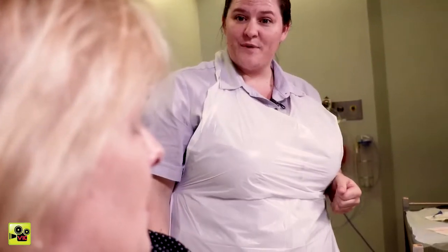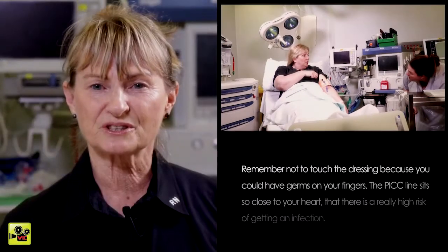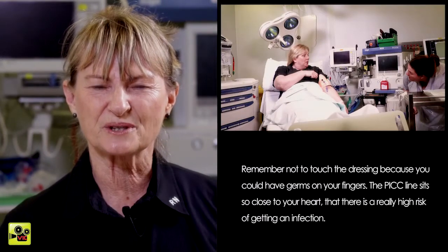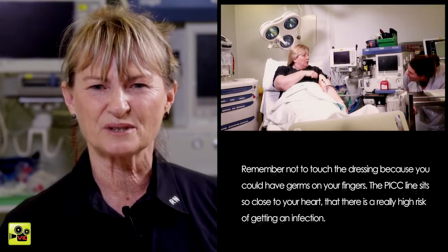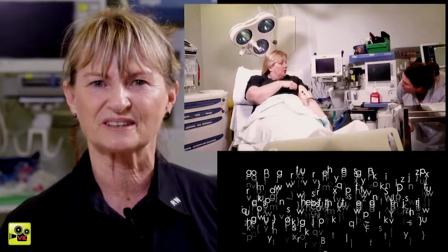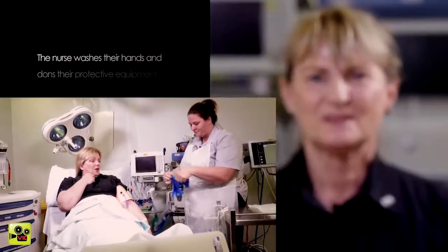Okay. I'm just going to go and wash my hands. I'll be back in a minute. Do you want me to take the dressing off for you? Remember not to touch the dressing. Your fingers could have germs on them. The PICC line sits so close to the heart that there really is a high risk of infection. Oh no, it's best not to touch the dressing at all. Leave that up to the nurses. It can cause infection if you touch the PICC.